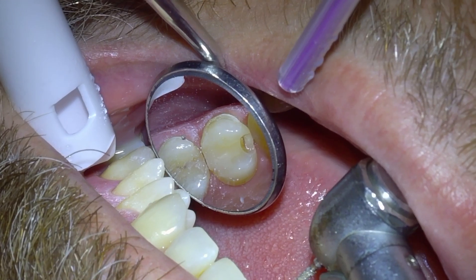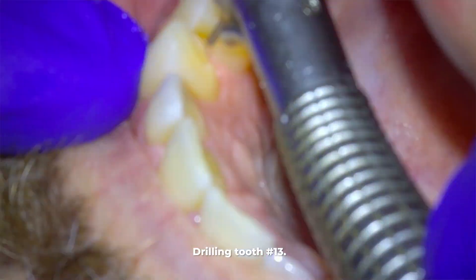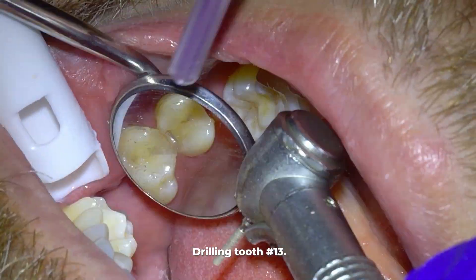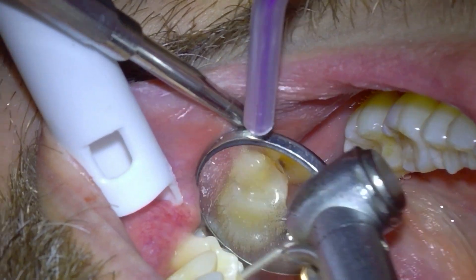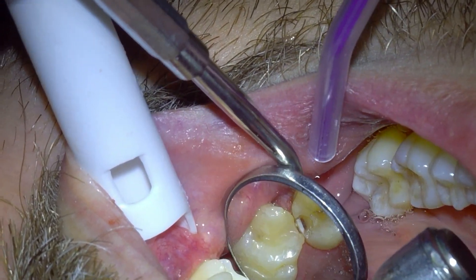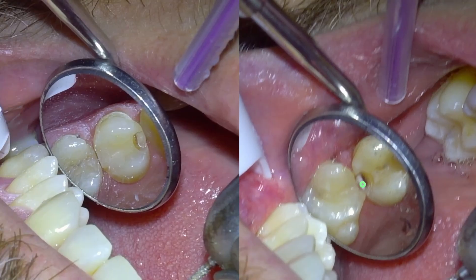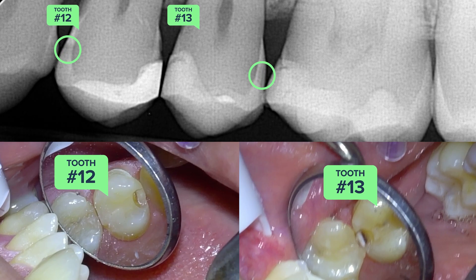Now that you've seen that decay, let's skip forward to tooth number 13, which is the majority of what I'll show for the rest of the video. I'm uncovering the tooth to expose the decay, and you can now see the decay on what we call the distal surface of number 13. This decay looks more intense than the one on number 12, but they look about the same size on the x-rays.